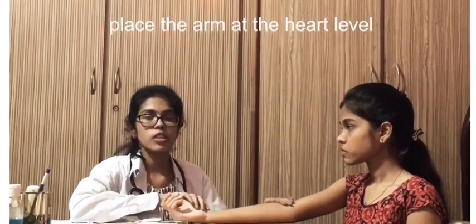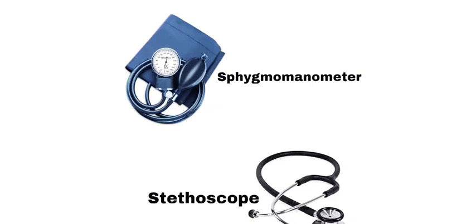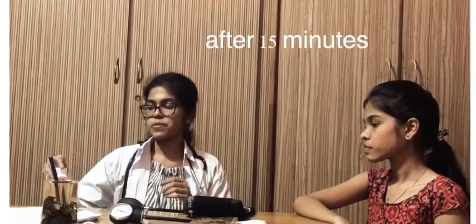Examine the arm to make sure there are no arteriovenous fistulas or dialysis access, brachial artery cut downs, or lymphedema. Now let's palpate the brachial artery for a viable pulse. Position the arm, with the brachial artery and the antecubital fossa, at heart level. Now let's take the blood pressure.